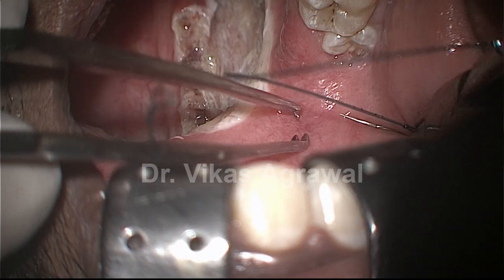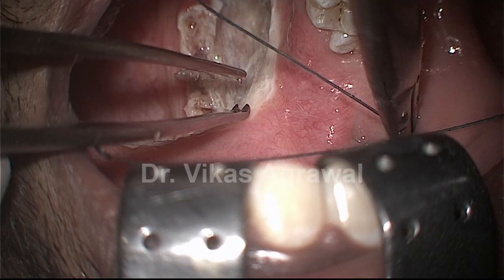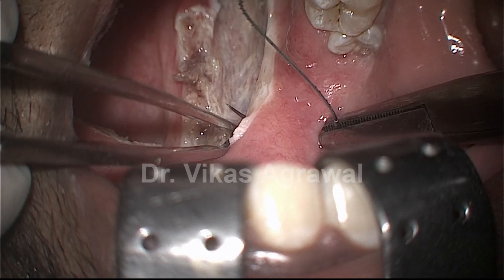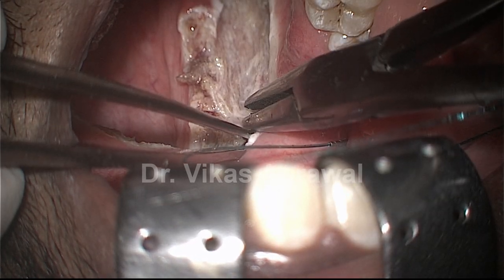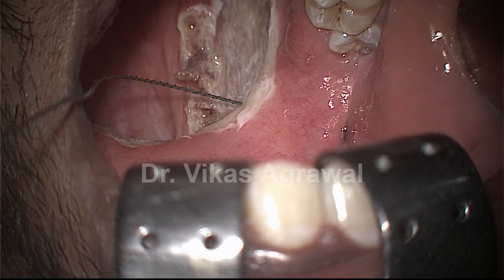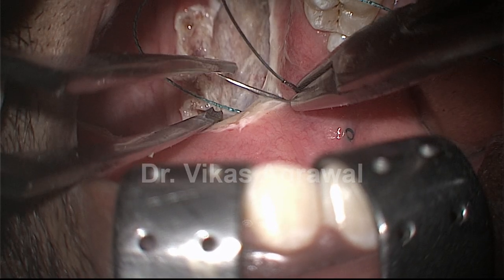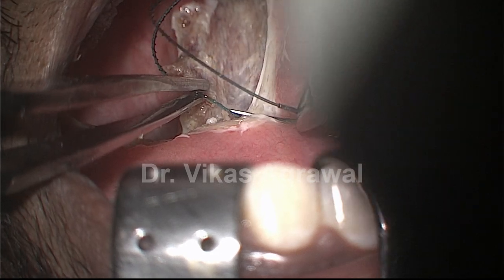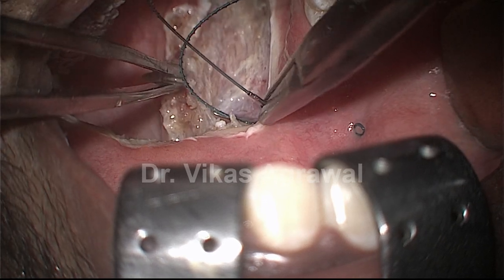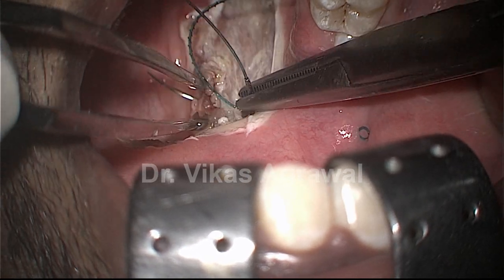I will be using the barbed suture so that once I take my stitch I do not have to tie knots. That is the pterygomandibular raphe. We go from the pterygomandibular raphe, come into the upper part of the tonsil fossa — the tonsillectomy has already been done — and we will take the bulk of palatopharyngeus muscle. We will not get into the mucosa; we will remain submucosal.